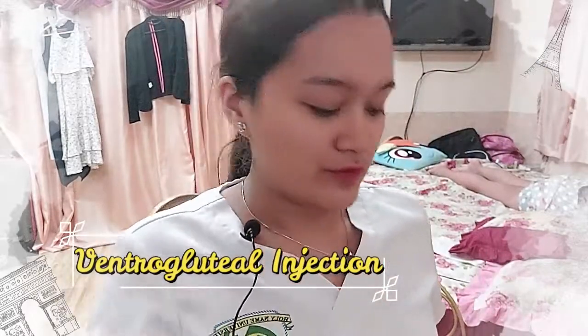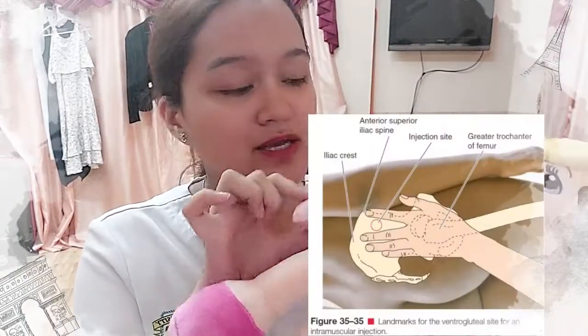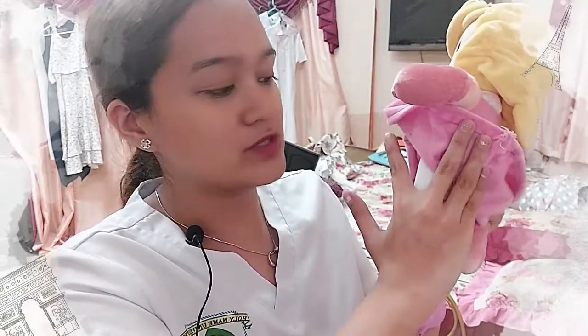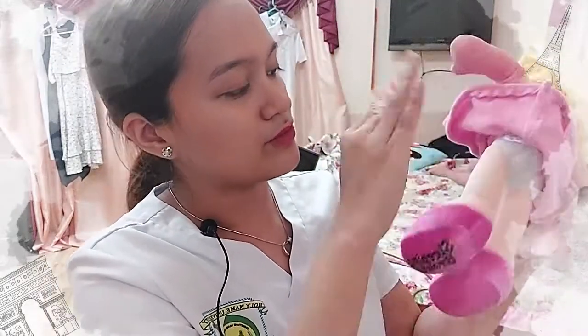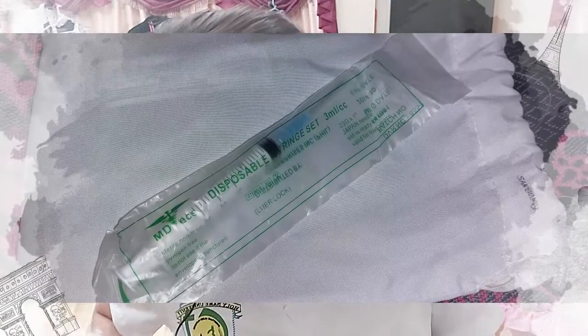Next, I'll be doing the ventral gluteal site. She can be in a lateral position. I need to identify the injection site by placing the heel of my palm at the greater trochanter, with the thumb pointing at her groin, the index finger pointing at the anterior superior iliac spine, and the middle finger pointing at the iliac crest. The V-shape formed between the fingers is the injection site. I need to prepare my other materials: I can use a 3 to 5ml syringe, and for the ventral gluteal site I'll be using a number 22 needle. You can also use a number 21.